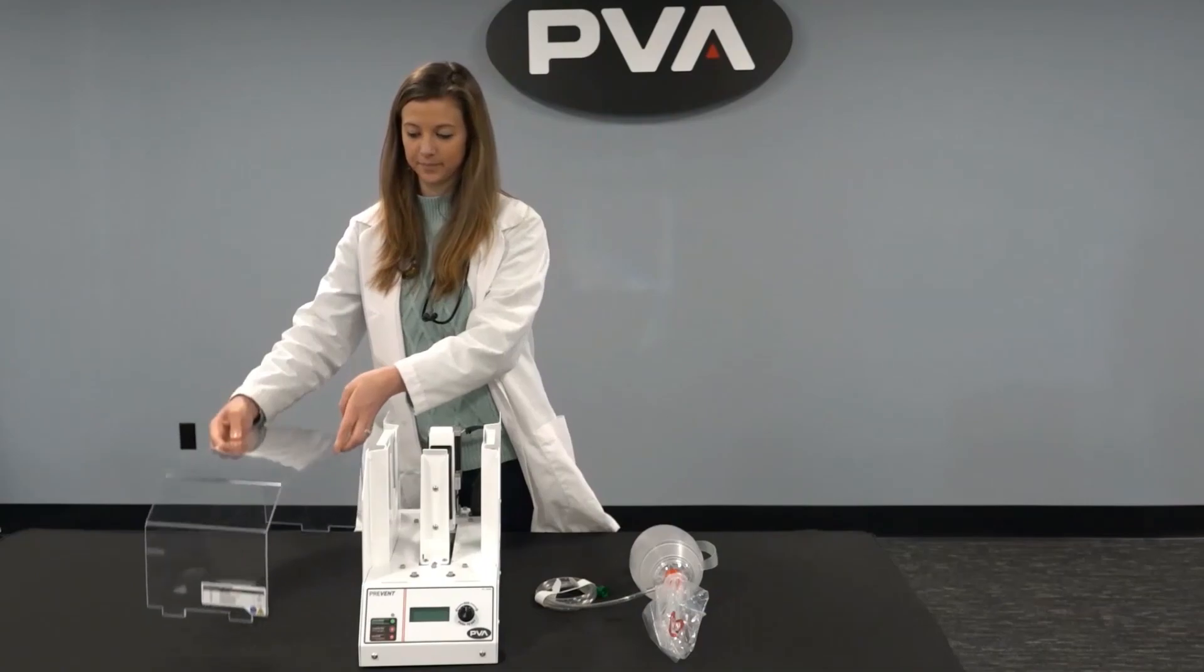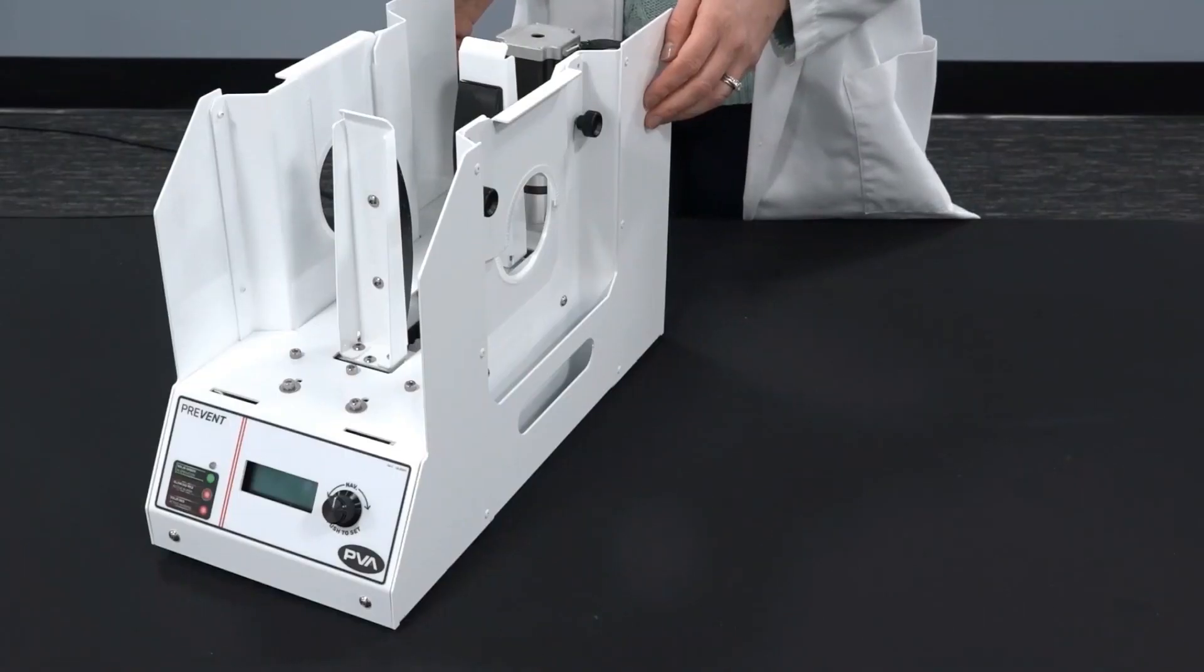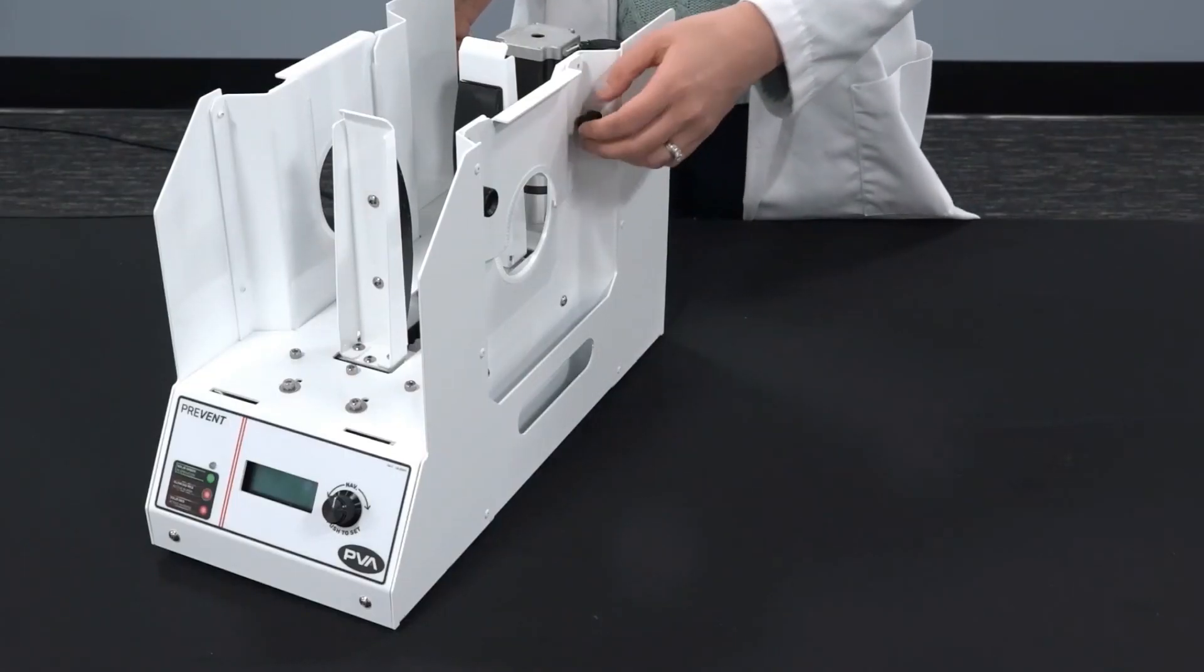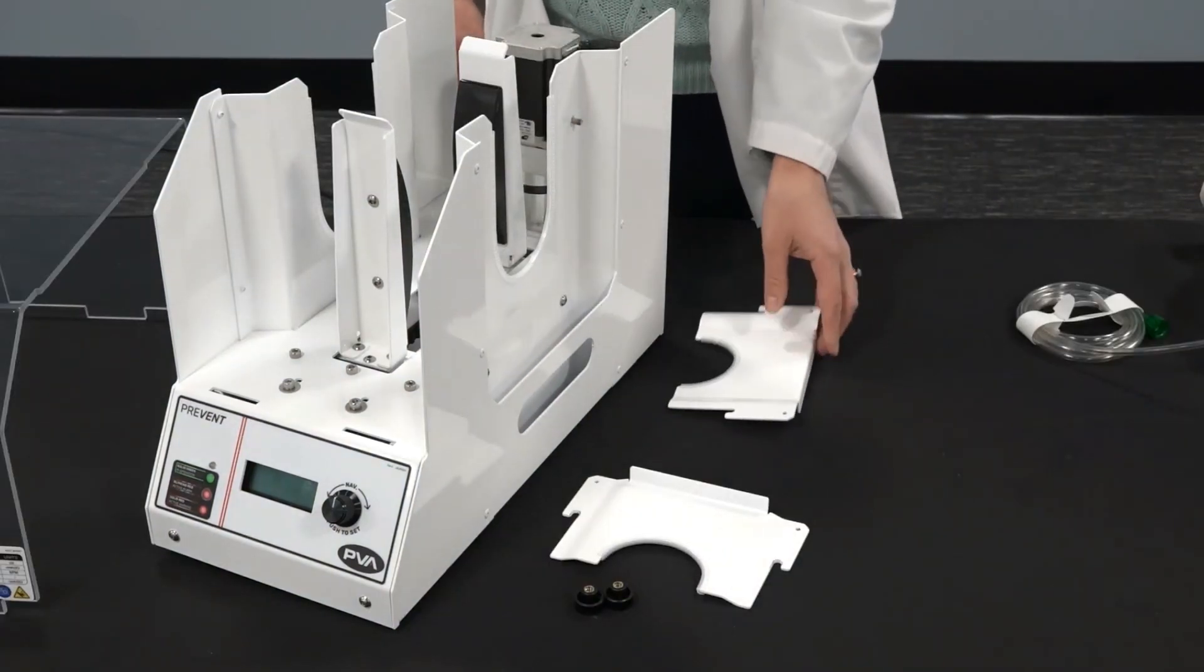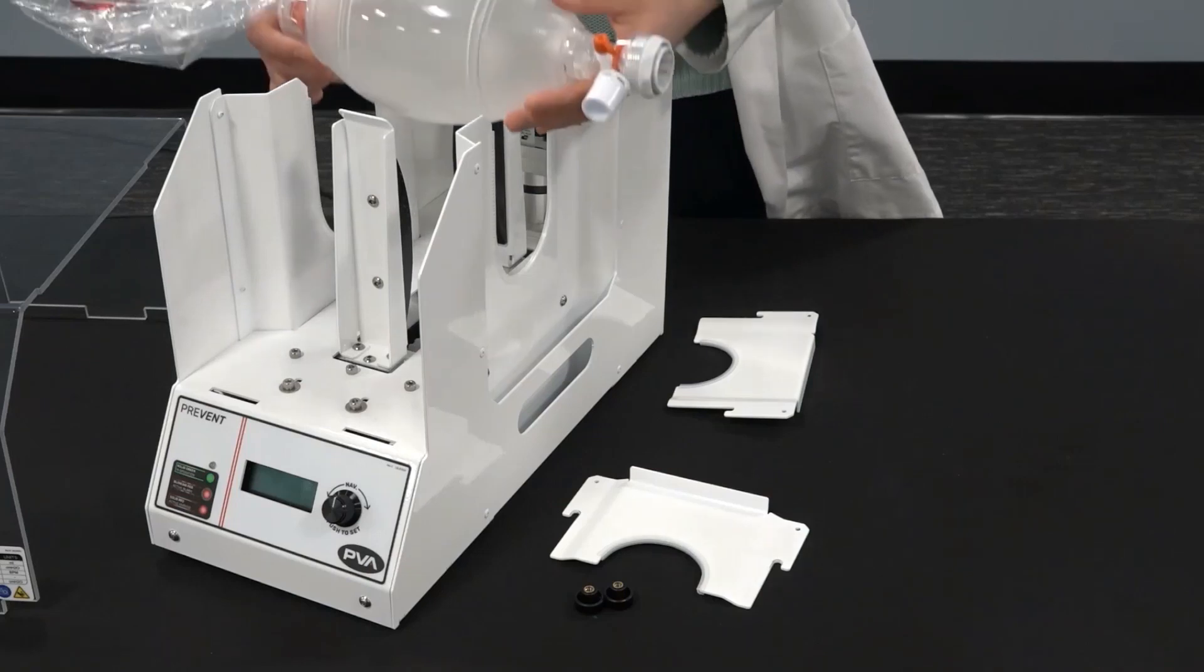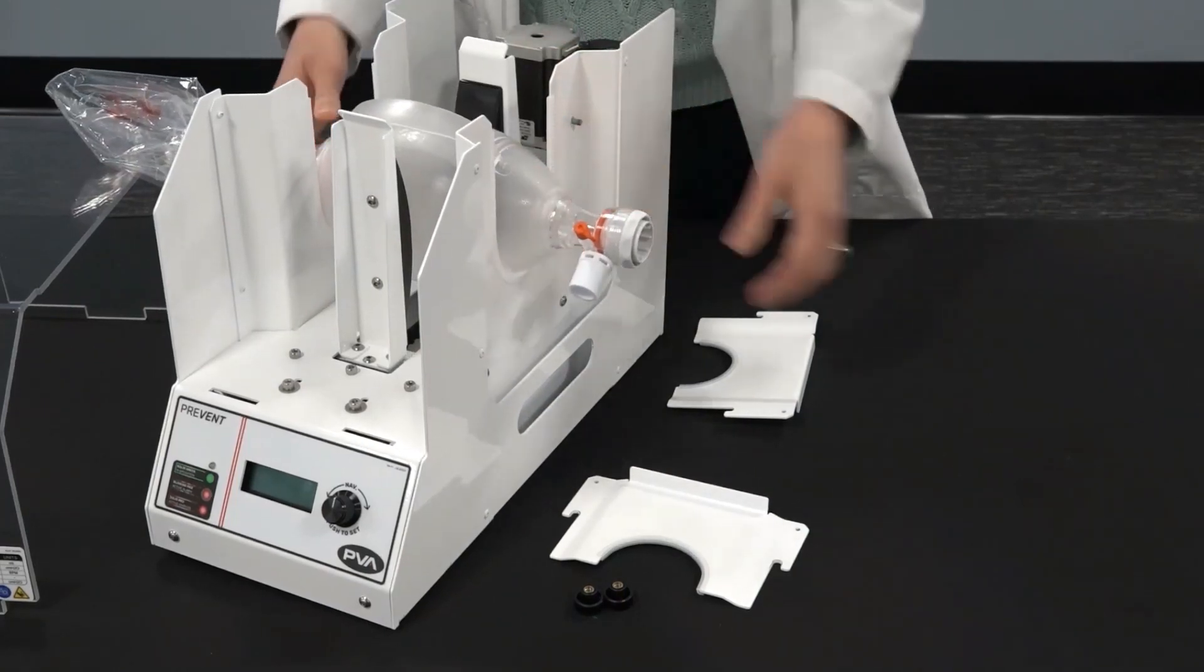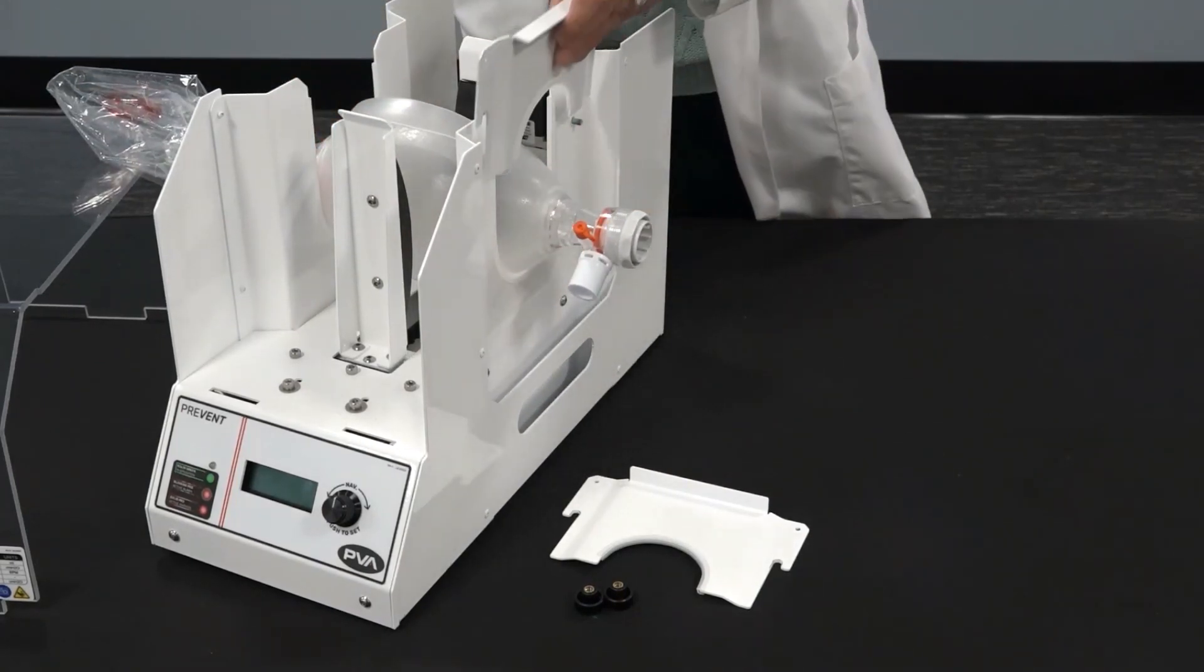Then remove the safety brackets. Then place the resuscitation bag centered between the arms. Reattach the safety brackets.